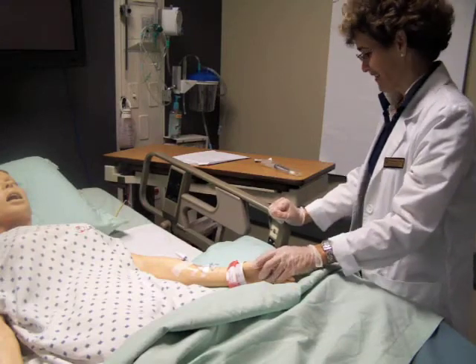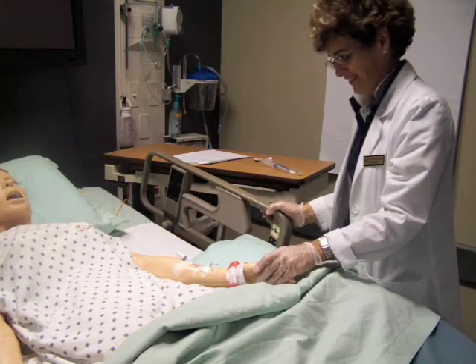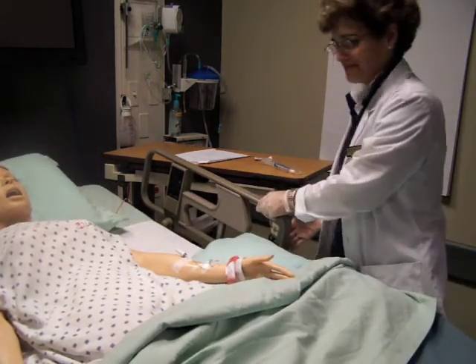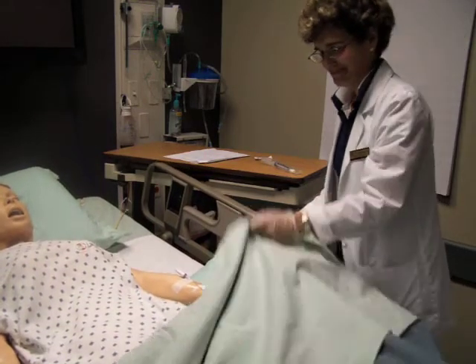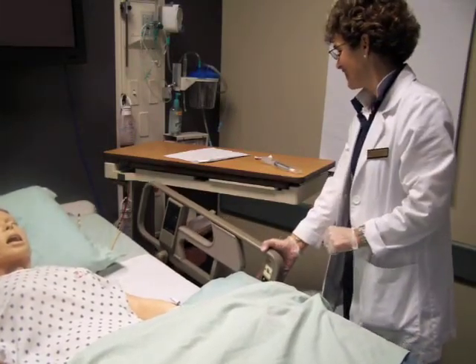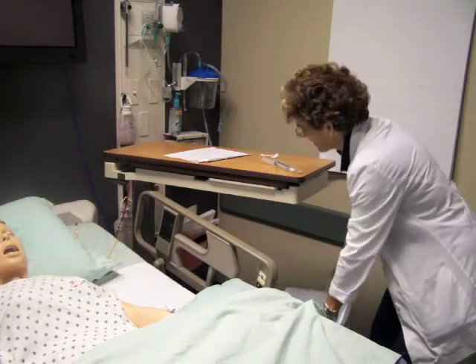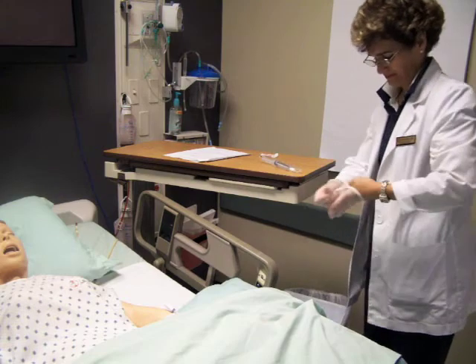Observe and/or assess the client closely for adverse reaction and response to the medication. Return the client in bed to a safe position. Discard supplies. And remove gloves and perform hand hygiene.